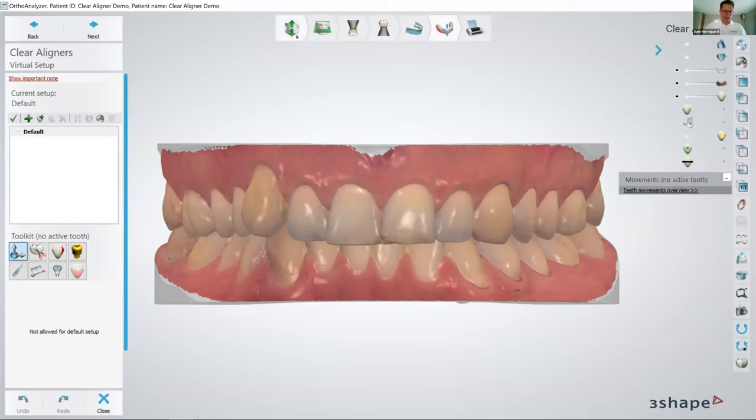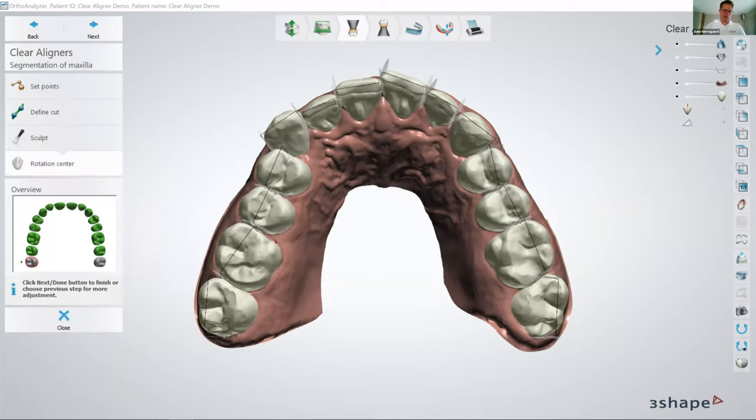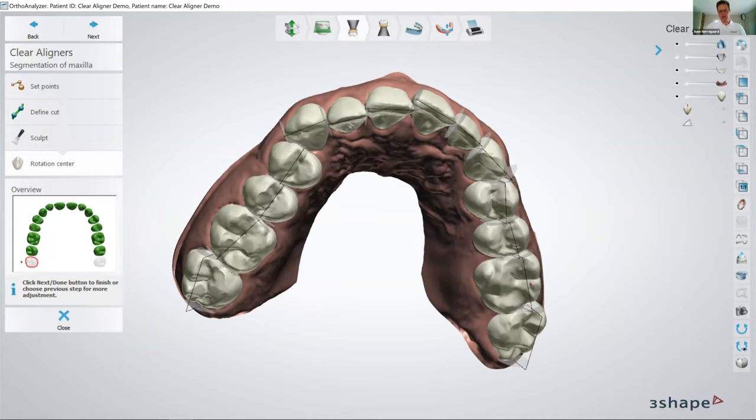And that will be creating occlusal planes, segmenting the teeth. First you segment the upper and then you segment the lower. I can show you what it looks like because it's already been done. We're not going to spend time on it, but basically it is just putting two points on each side of the teeth, defining the exact width of the teeth. And you also define the X or the long axis line, as we call it, for the tooth. And then the software will cut out each tooth and turn them into individual objects.